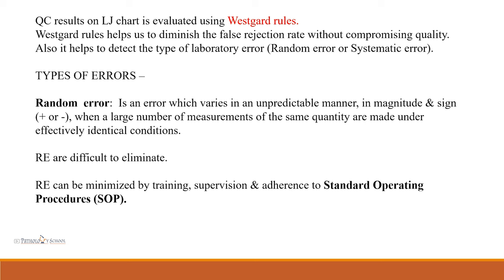These results are evaluated using Westgard rules. Westgard rules help to diminish the false rejection rate without compromising quality, and they help detect the type of laboratory error — whether random or systematic. A random error is an error which appears in an unpredictable manner, unpredictable in its magnitude and sign, even when a large number of measurements of the same quantity are made under identical conditions. Random errors are difficult to eliminate.